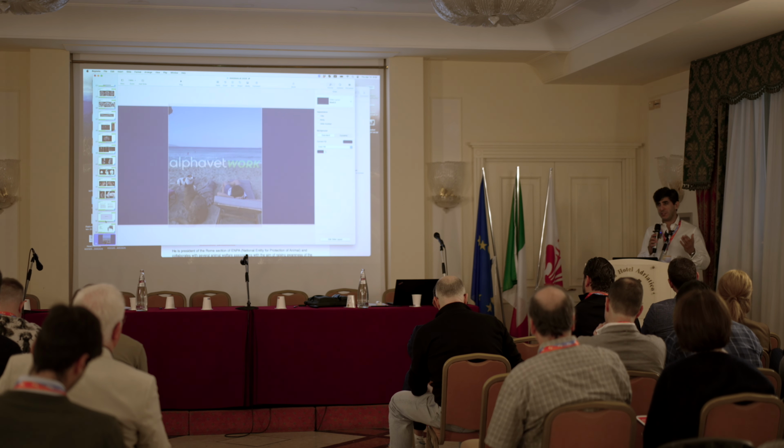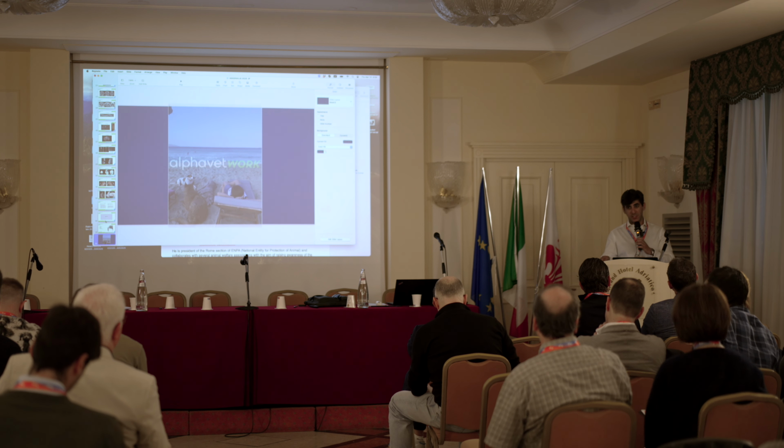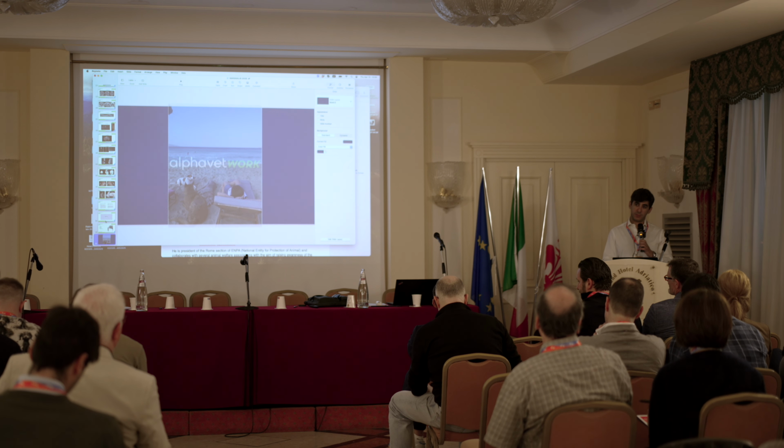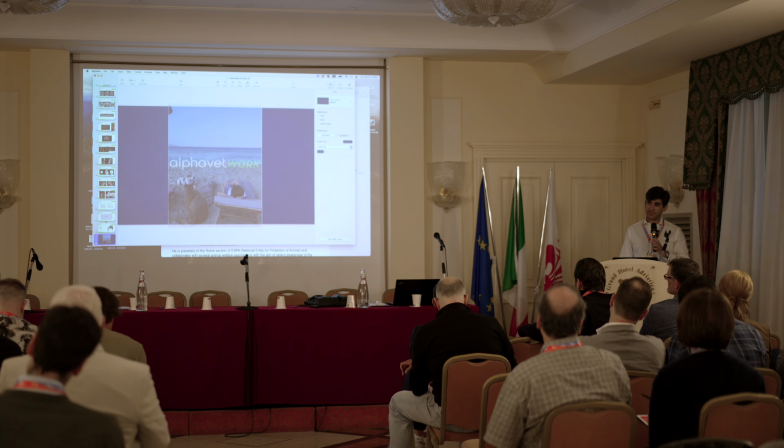And in Greece now there is a big fund that they're producing like a diagnostic imaging center. I said, you should have standard a CBCT. And when you buy a CT or a CBCT, the same day you should buy the ventilator for the apnea and the power injector for the contrast medium. This is something also in CT, but also in CBCT, is mandatory to increase your image quality.